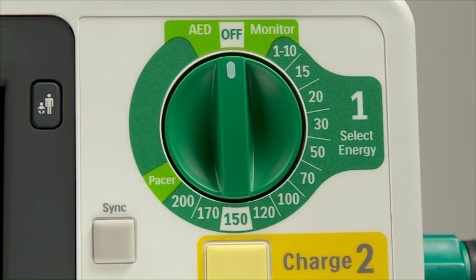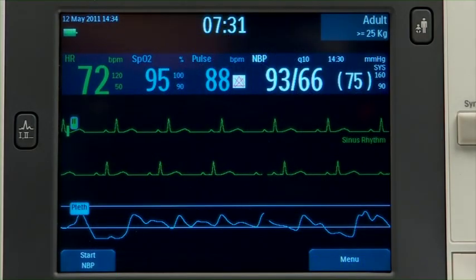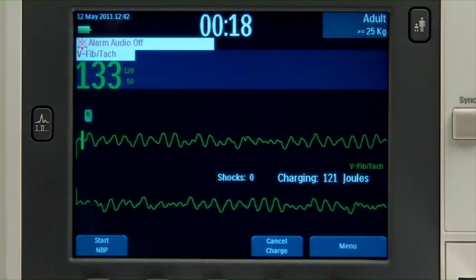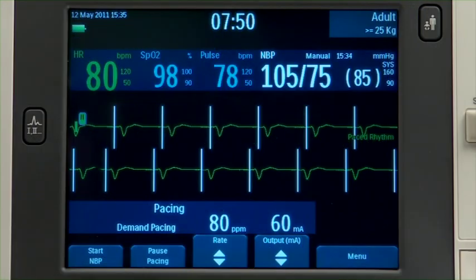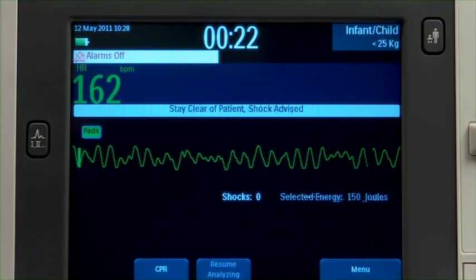The XL Plus provides four modes of clinical operation: monitor, manual defibrillation, pacing, and semi-automated external defibrillation.